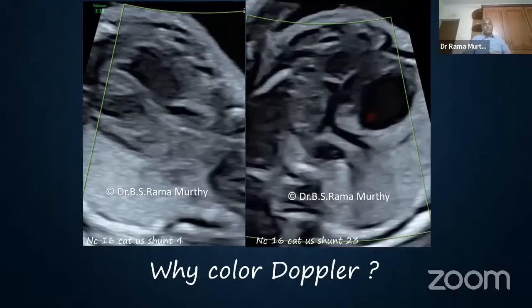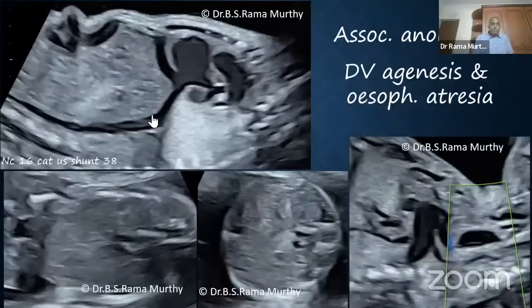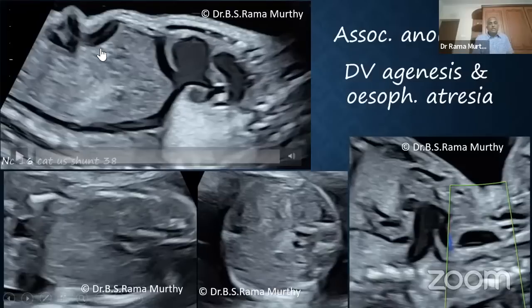And going on with the same case, remember, this was a CAT type 1. In the same case, you will find a ductus venosus agenesis, and you will find an umbilicosystemic shunt, the umbilical vein going all the way up, going over the liver and draining into the IVC just before the IVC gets into the heart. So that's an umbilicosystemic shunt, DV agenesis. Most probably the portal circulation is not there. The intrahepatic portal system is not there.